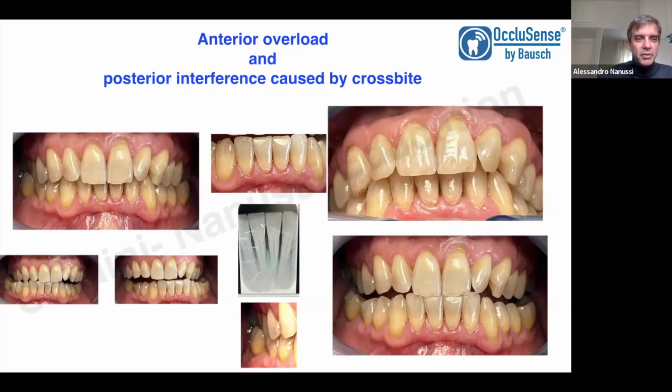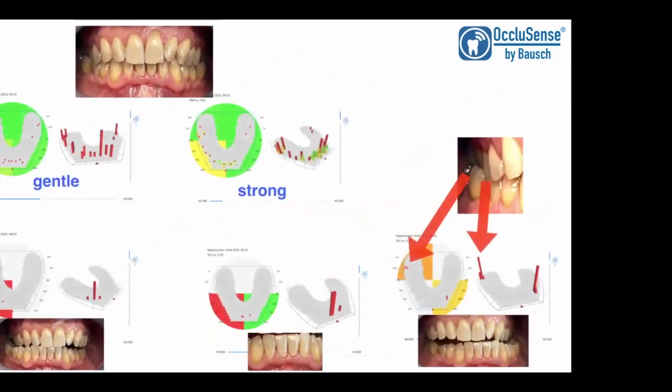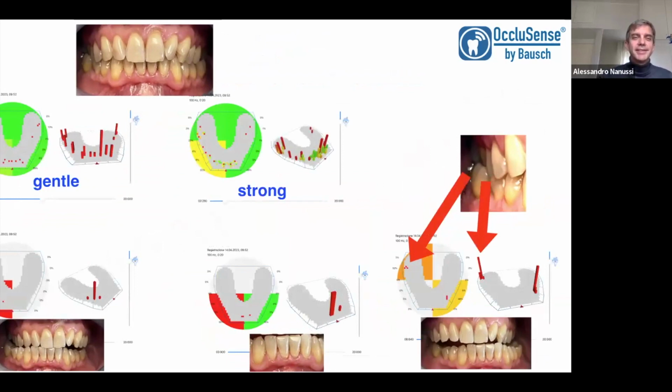Well, this patient has a good lateral disclusion. You can see it is a good canine guidance, I think, and the problem is related to anterior load. Let's see how the forces are that he exerts during the movement. Well, if he closes his mouth and clenches the teeth gently, he shows me only some red points of contact that you can see in the report. Well, he had to clench very strongly to show me also green and yellow areas. That means areas of overload and bruxing. The lower anterior teeth are overloaded, and sure, they have a problem of horizontal bone resorption, and some movement of the teeth.